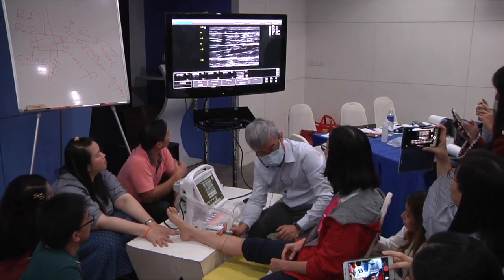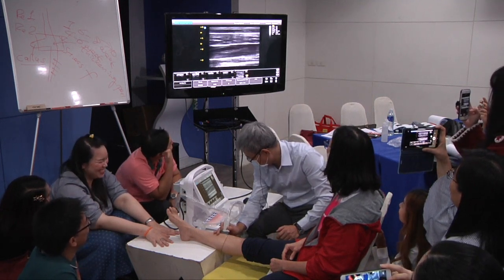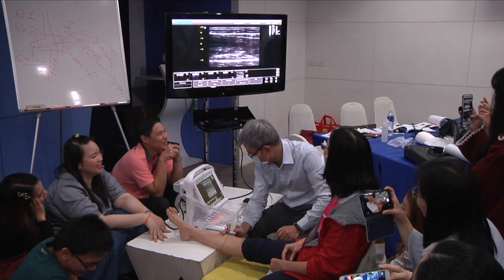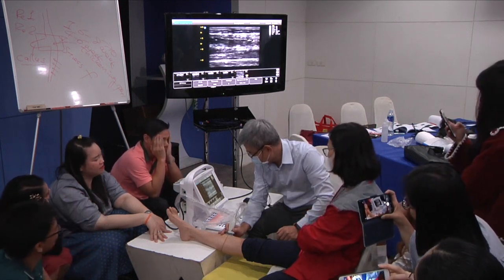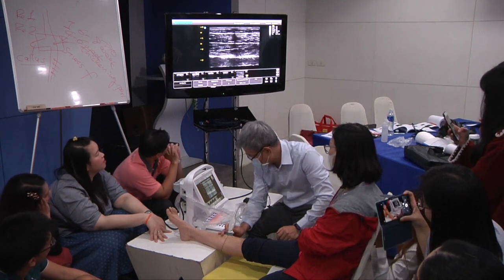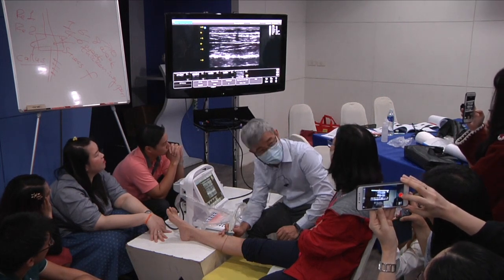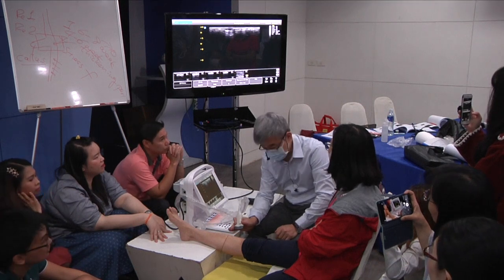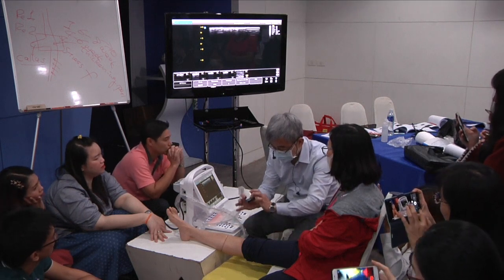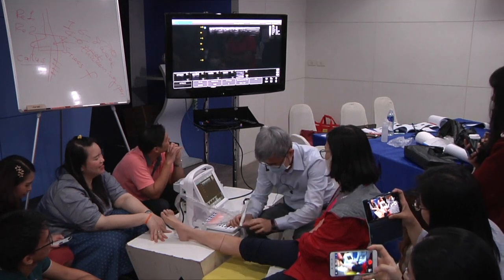I can cheat you like this. Go. Oh, relax. Go. Relax. That's cheating, right? Okay. So sometimes students cheat. Yeah. Okay. With the shadow in the middle, I know my hand was not moving. Okay? Try this when you practice. Okay, start again. Hey, very useful. I always know where it is. Good.